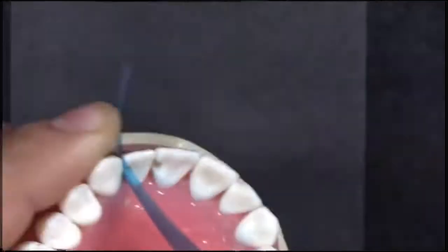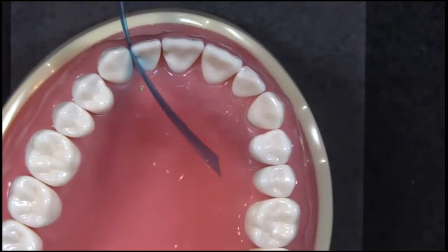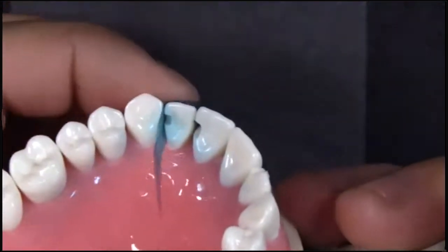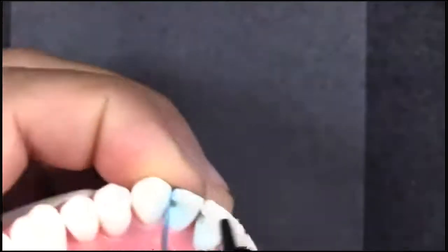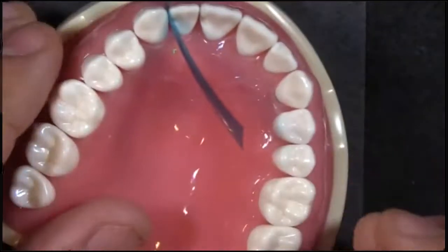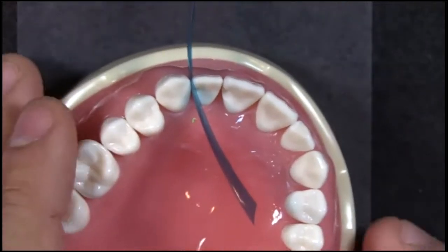I know that you guys don't need a whole lot of show and tell with this, because everybody's pretty familiar with how to use these strip type systems. But essentially I'll go ahead and fill this. Typically I would put a wedge in here. In terms of where you wedge from, we lost our screen here for a second.